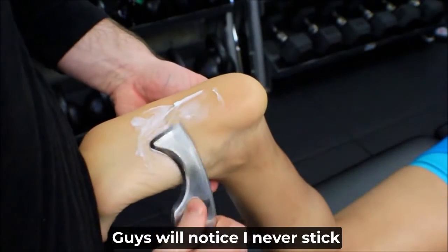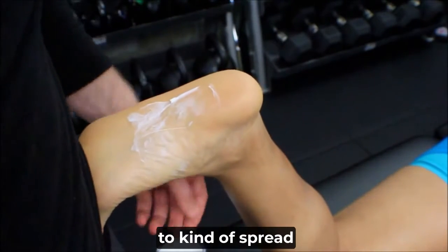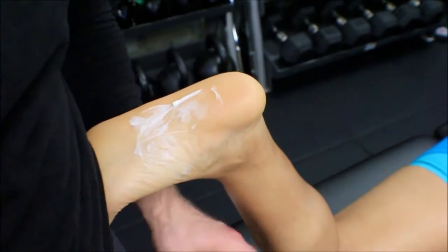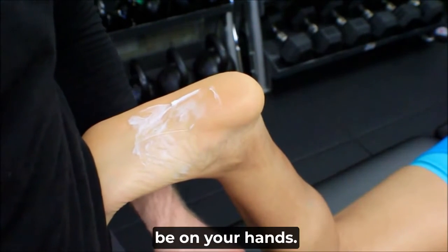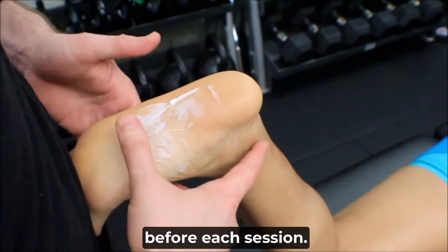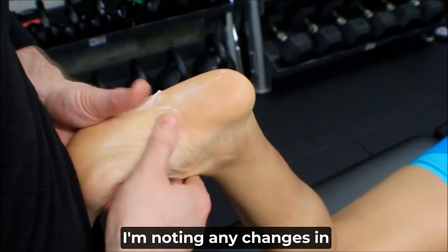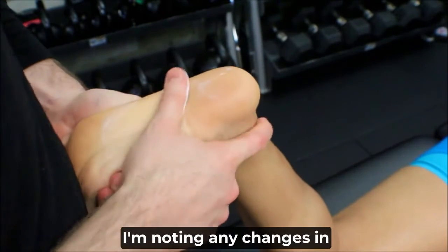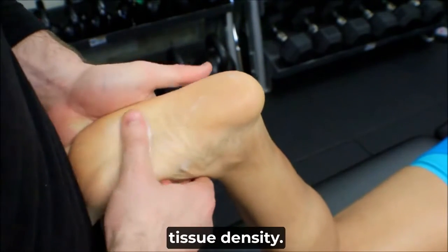You guys will notice I never stick my fingers inside the cream. That's just a good way to spread any dirt and grime that might be on your hands. Rather, use a freshly cleaned tool before each session. All right, and then I'm just going to go ahead and rub this in. Once again, I'm noting any changes in tissue texture or differences in tissue density.